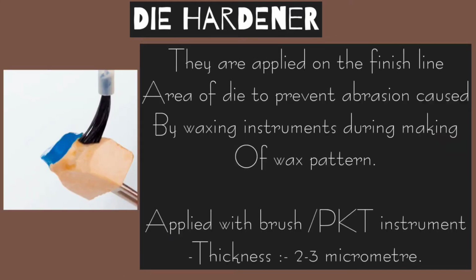Die hardener is applied on the finish line area of the die to prevent abrasion caused by the waxing instrument during making of the wax pattern.